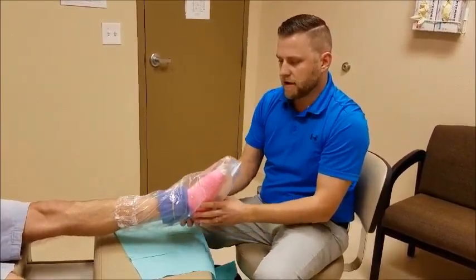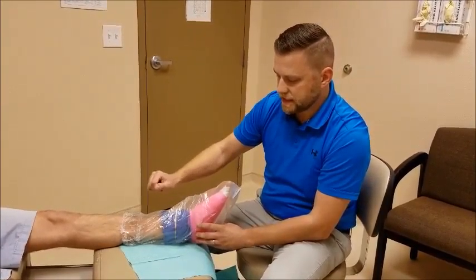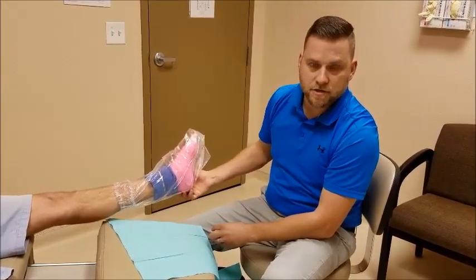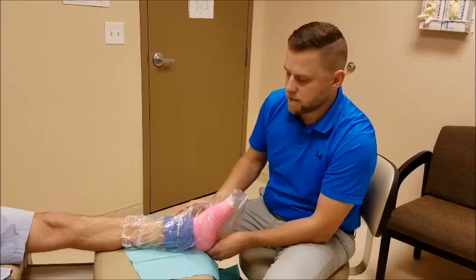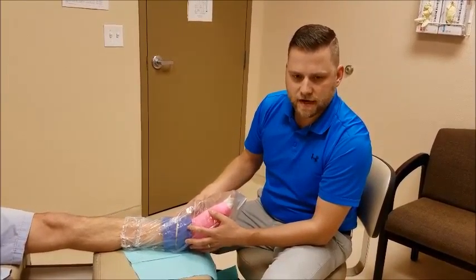When you're in the shower, try to keep your leg away from the water as much as possible. If you have a wand, use that instead. Some people take baths — you can do that, just hang your leg outside the tub and make sure you don't accidentally slip and get it inside. Make the shower very quick, because the leg will sweat being inside a bag too long.